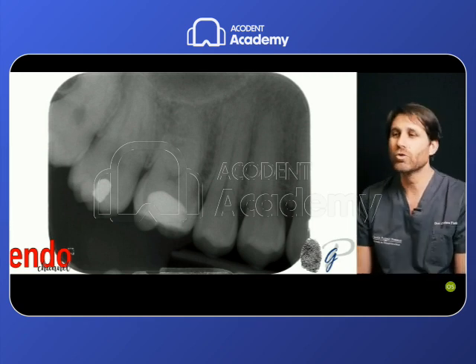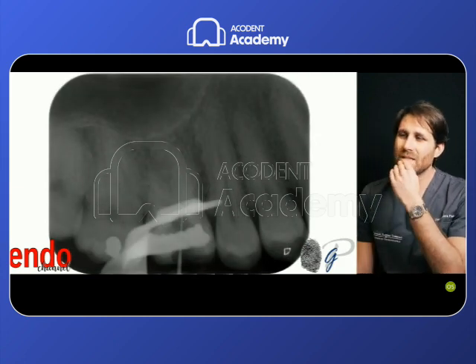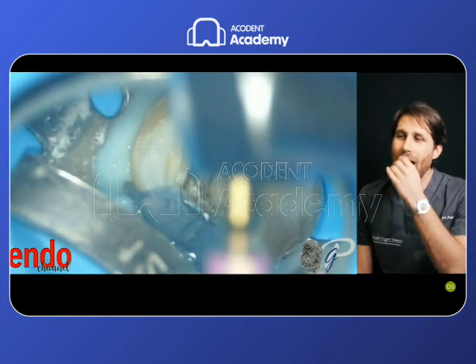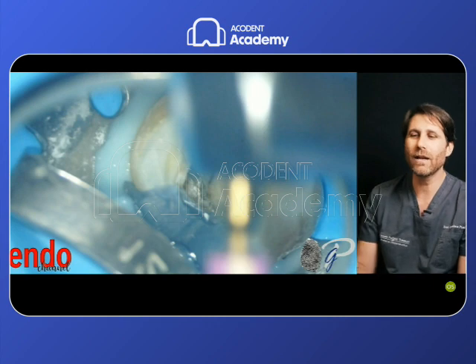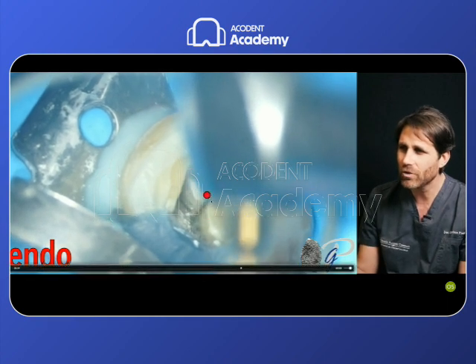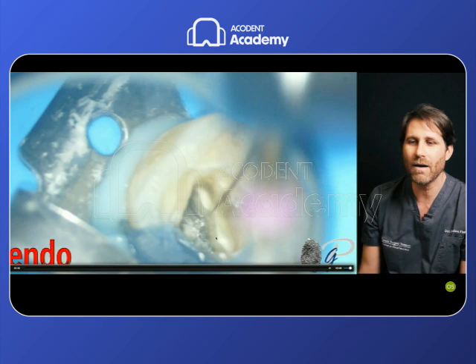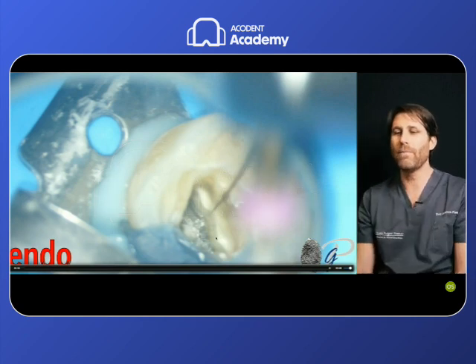Let's have a look at another case solved with an approach again using multiple files to solve this situation. The MB1 root canal was scouted while the MB2 root canal was impossible to scout. I started in this case, as I always do, with the file that I consider less effective, the WaveOne Gold Glider, trying to scout the MB2 root canal, but look how soft it is, how much it bends. It bends very much, and it does not have the power to penetrate this impenetrable root canal.